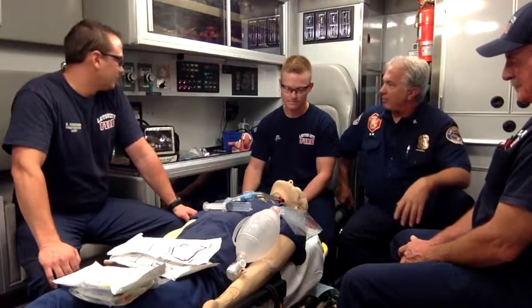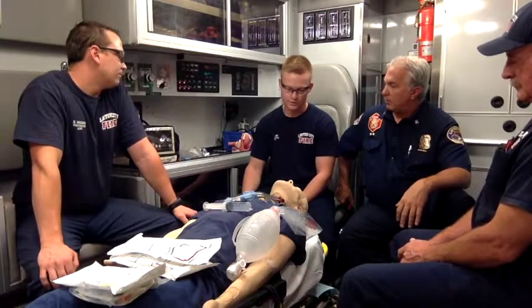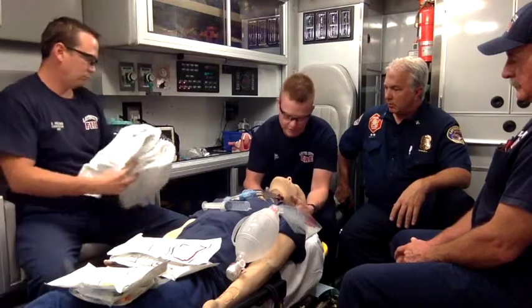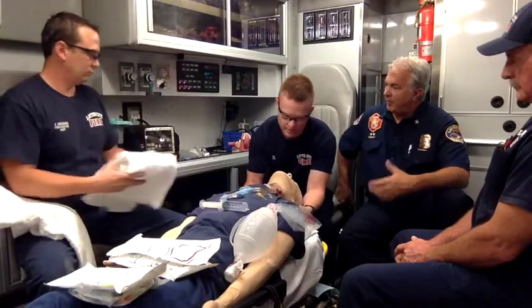O came and talked to us about those first few minutes of cardiac arrest management and gave us some direction on what he wants us to do. We want to position the patient appropriately. We want him up in the sniffing position. And that may entail a pillow or towel. And in fact, will, right?